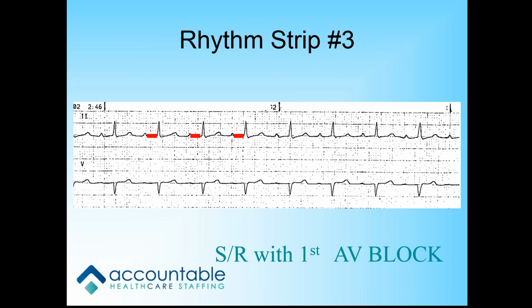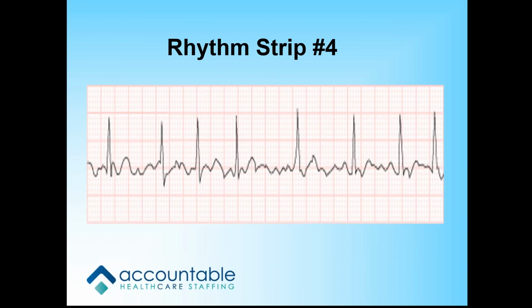And any other questions on that, Crystal? No, I'm good. Okay. Perfect. Thank you. Irene? Yes. Hi, Irene. Okay, here's rhythm strip number 4.